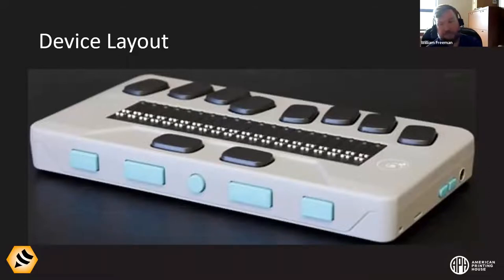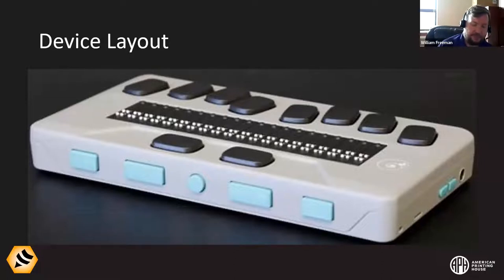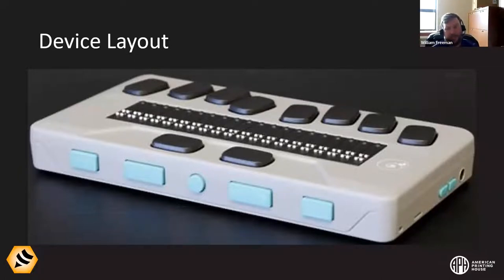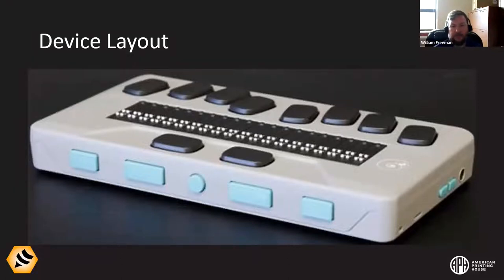On the front edge of the device you've got the thumb keys and the home button. The home button is that round button in the very front and middle of the front edge, right between the two space bars but down on the front edge. You can think of the home button as your escape hatch — if you're ever lost or confused, press the home button and it will always take you back to the main menu so you can reorient yourself.